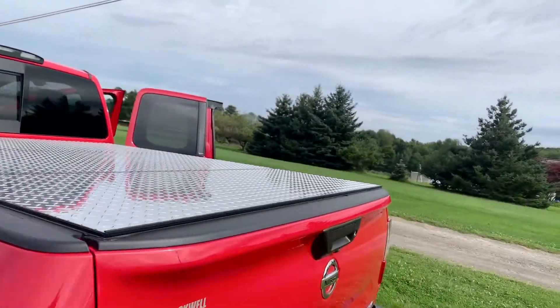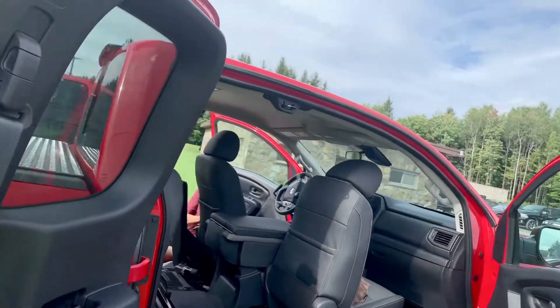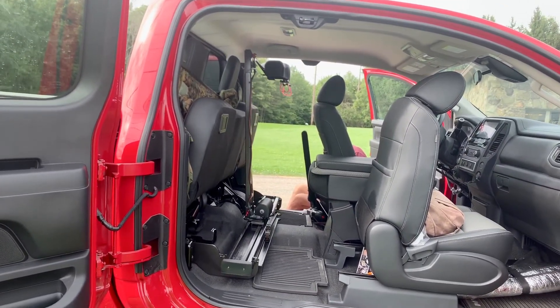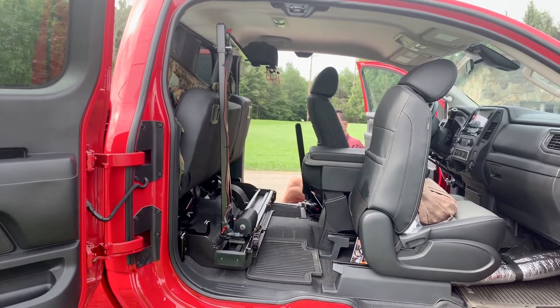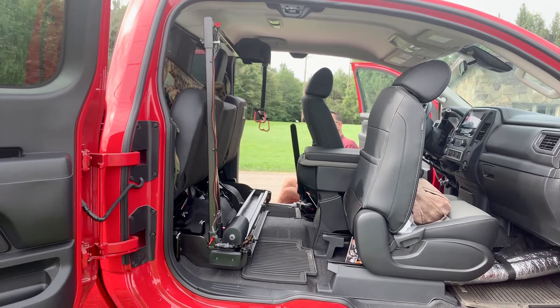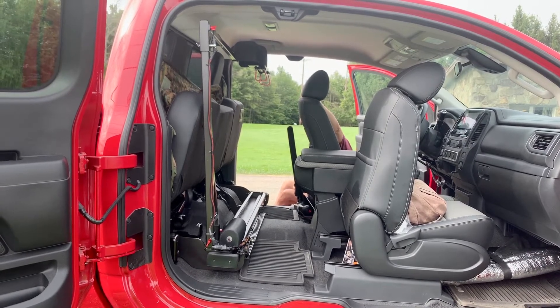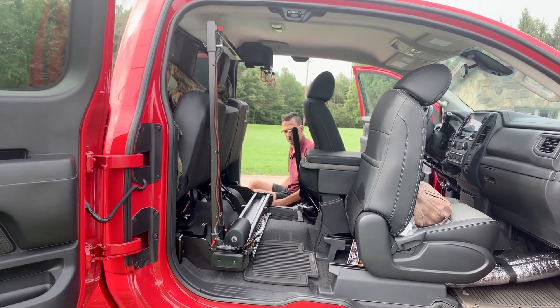We're going to take you around the other side so you can get a different view of the unit. I'm going to run it in and out for you, and up and down. If you notice where the unit goes, we try to make it a little high so that you still have a good part of your vision through the rear mirror. We tried to think of everything and make everything as unobtrusive as possible.